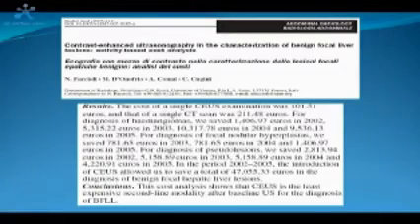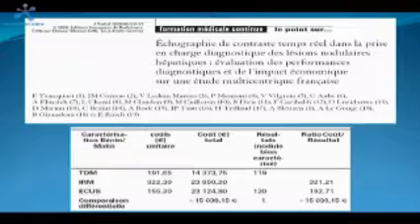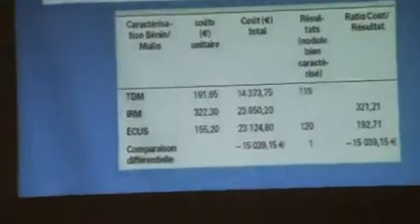And this other Italian study highlighted how the cost of the single examination is lower than CT, and so in this period they could save a consistent amount of euros. And also in France they could see the lower cost of CEUS in comparison with CT and MRI, and this is the number of euros in the end they could spare using CEUS instead of the other imaging modalities.